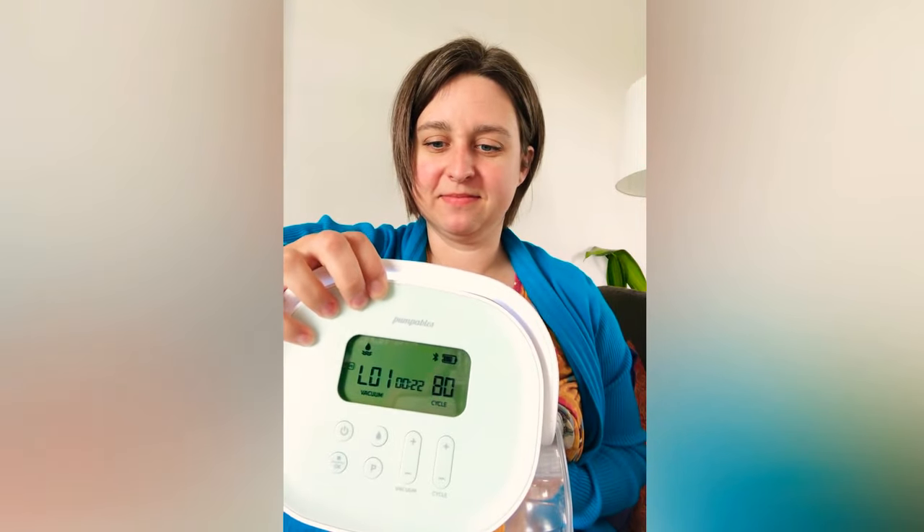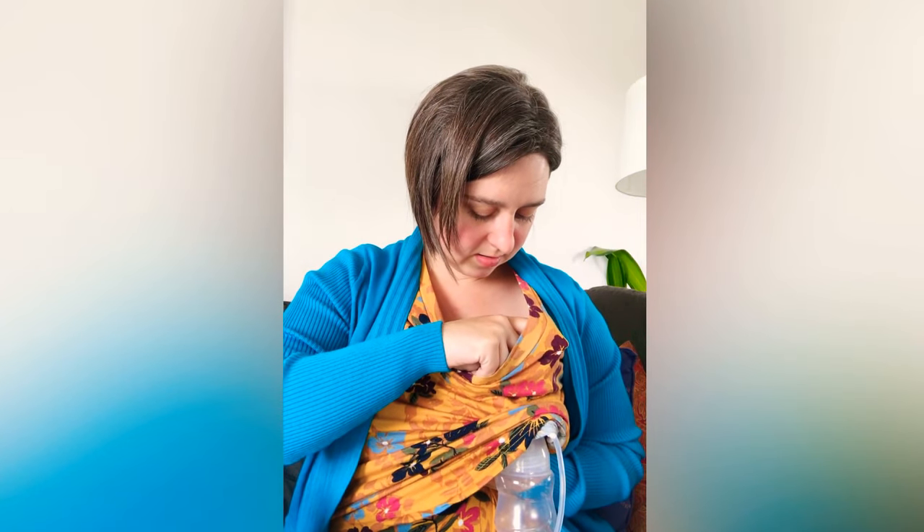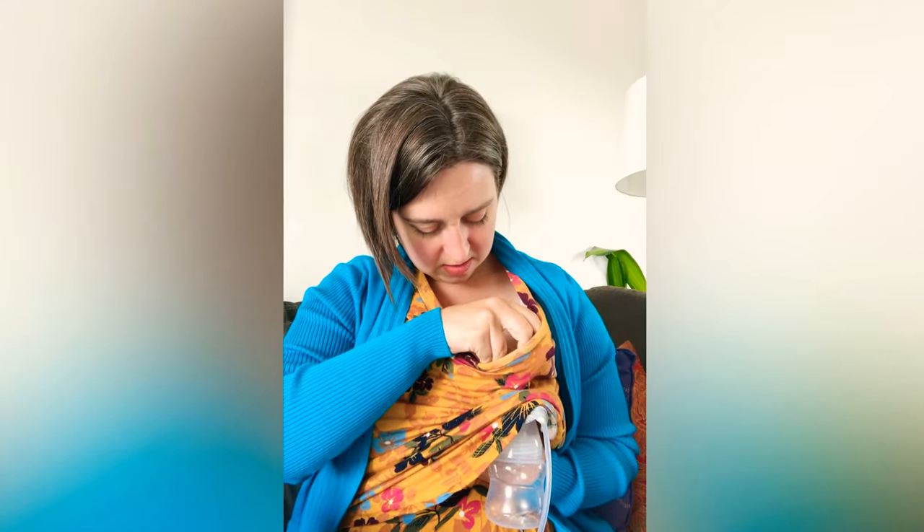It started on the letdown mode automatically, which is awesome. I'm going to bump up the cycle speeds to 104 because I like stimulation mode a little faster. Vacuum level one is a little light, so I'll go to three — okay, that is super comfortable. That plastic piece inside is moving in and out and it is really, really cool. It is super comfortable and I've never seen a flange work like this before.